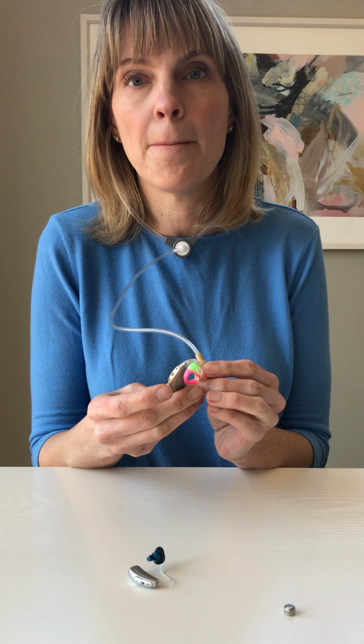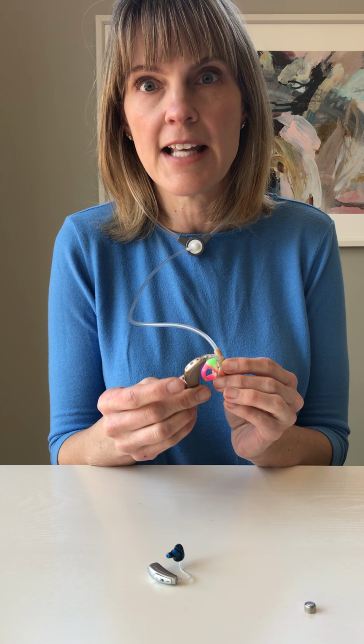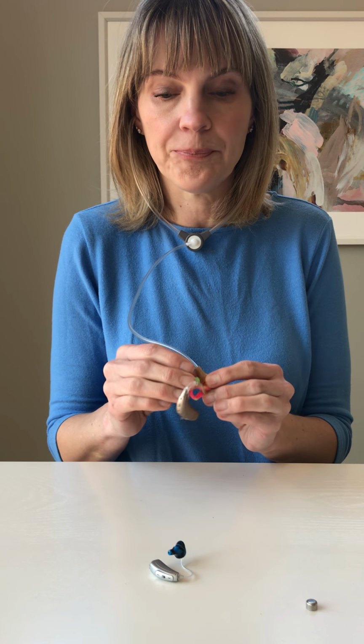I use my listening tube by putting it in both ears and then putting the end over the end of the ear mold. And then I can take a listen and I can repeat the same phrases every time so I have an idea of how those phrases would sound. So I can say something like the Ling sounds, ah, ee, oo, sh, s, or I could say sidewalk, baseball, hot dog, but just something so that every day I have the same idea of what those words or sounds should sound like through my hearing aid.